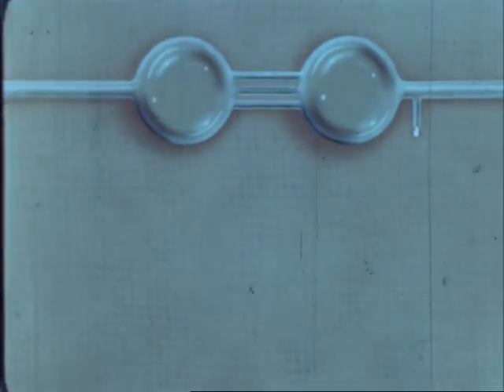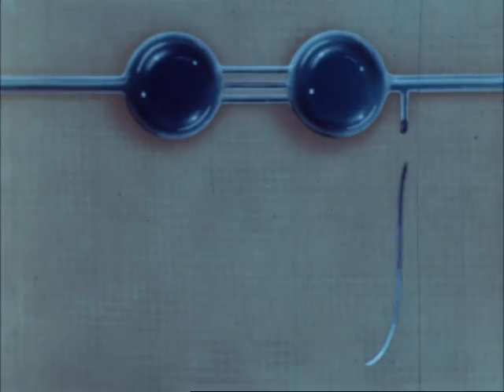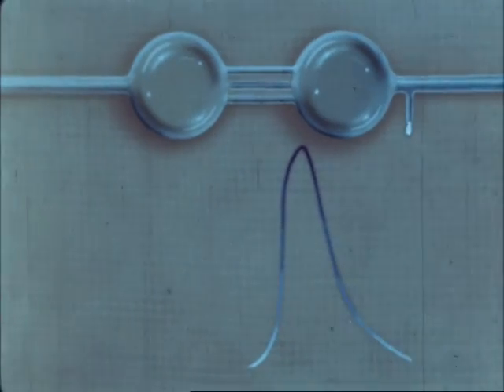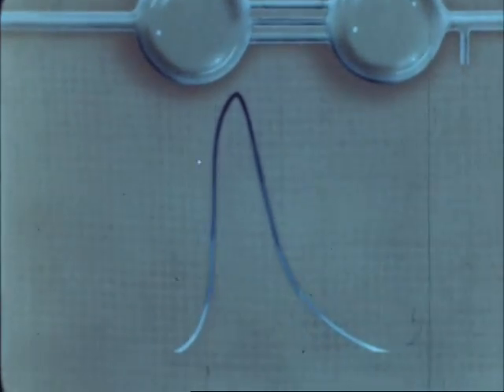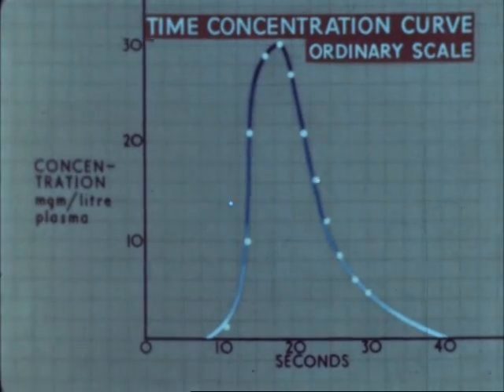In timed samples from an exit tube, the concentration of dye will rise steeply at first, and then the intensity of color will fall away. An estimation of the concentration of the dye in each timed sample permits the construction of a time concentration curve.